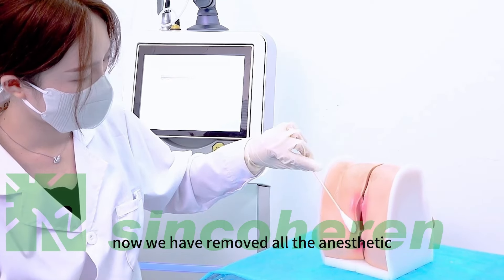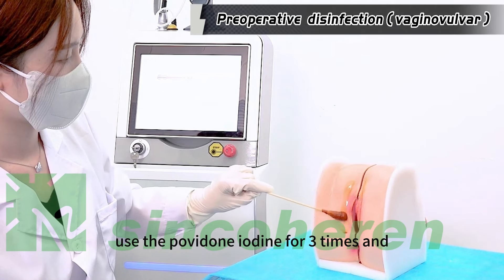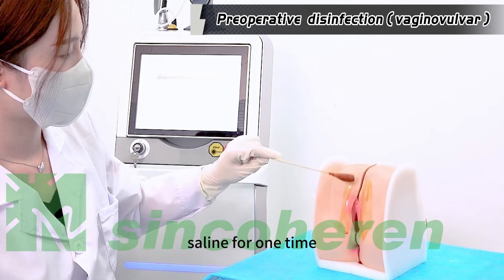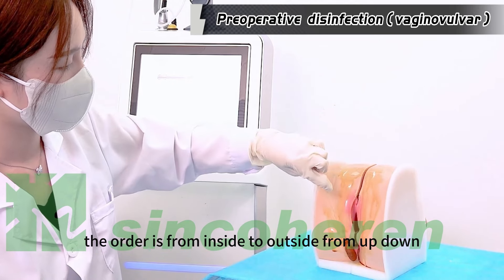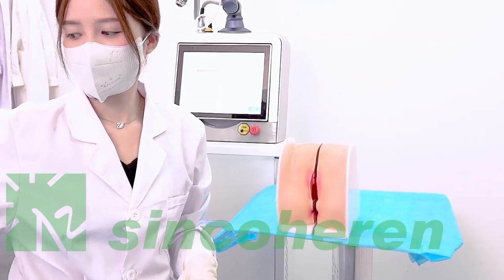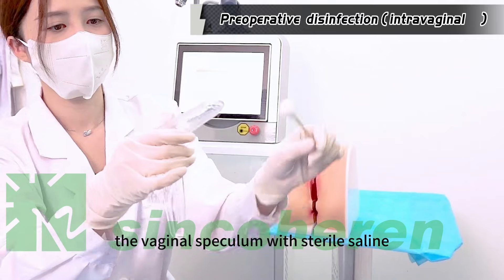Now we have removed all the anesthesia. Apply povidone-iodine three times and saline one time. The order is from inside to outside and from top to bottom.